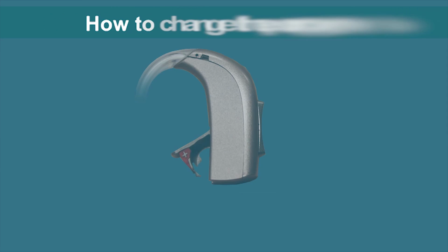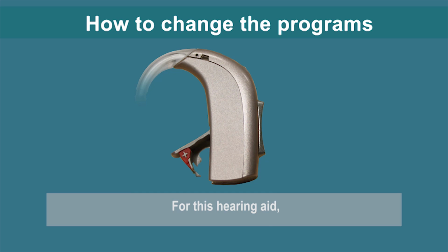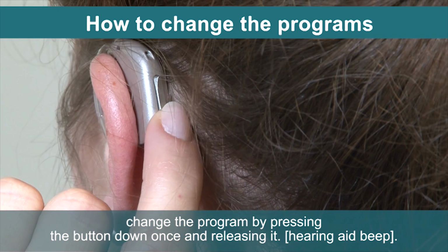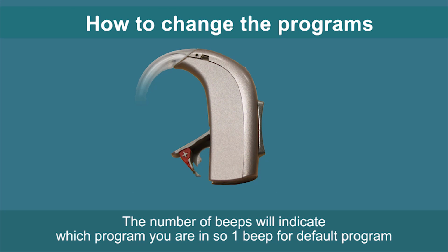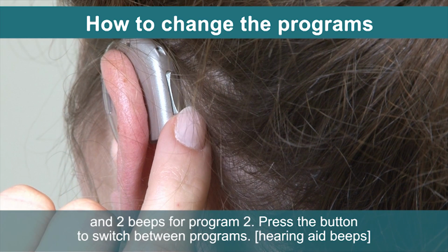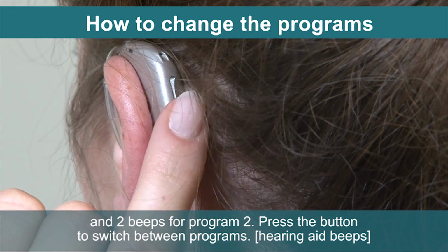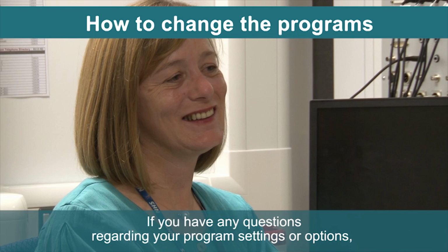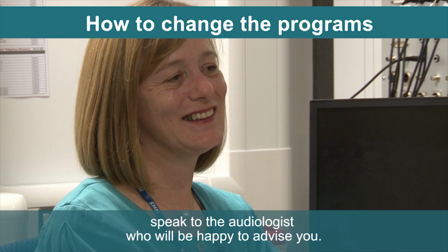How to change the program. For this hearing aid, change the program by pressing the button down once and releasing it. The number of beeps will indicate which program you are in, so 1 beep for default program and 2 beeps for program 2. Press the button to switch between programs. If you have any questions regarding your program settings or options, speak to an audiologist who will be happy to advise you.